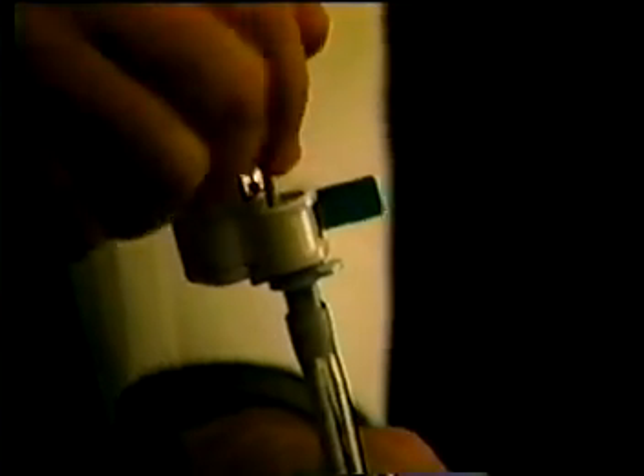Once again, holding the tube against the lips, release the locking lever. Grasp the TrachLite handle and with firm pressure, pull the TrachLite out of the tube.